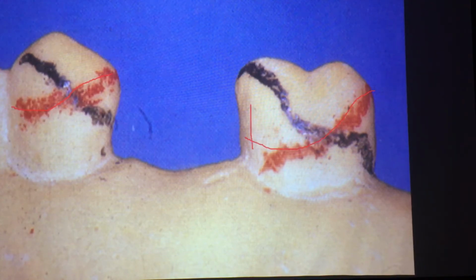So this is the undercut that should be 33% that I'm going to engage below the height of contour with my retentive arm. The only retentive arms you made so far are, I guess in ortho you've made some different retentive arms, but in acrylic partials it's just the stainless steel wrought wire clasp. And I told you to put it down there somewhere, halfway between the gingiva and the occlusal of the tooth. We're going to do this today on our one abutment tooth on each side of our class 1.